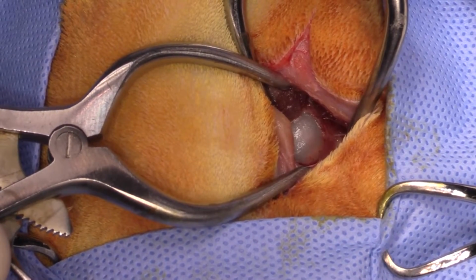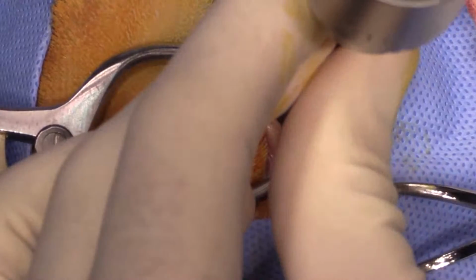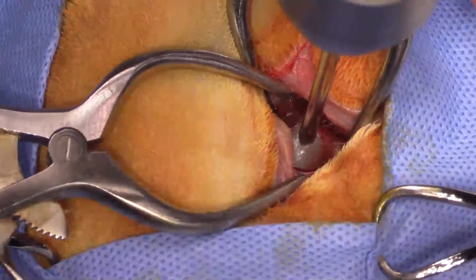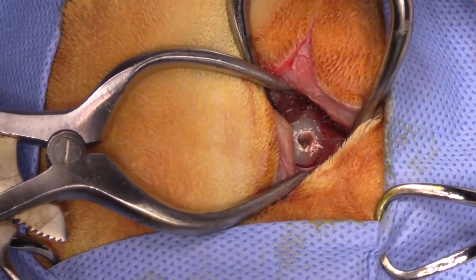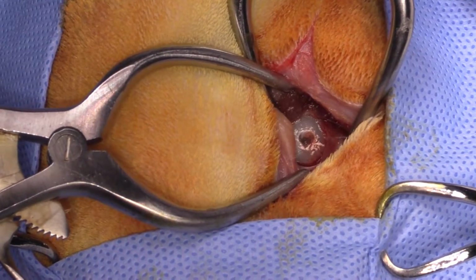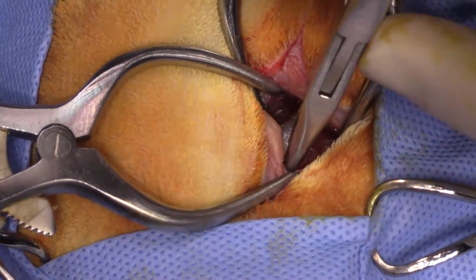All right, so I'm using an IM pin to perforate the bulla. You can see how I've gotten right in there, and then I'm going to use a rongeur to expand my bulla osteotomy. I just use a Lempert rongeur for starters.